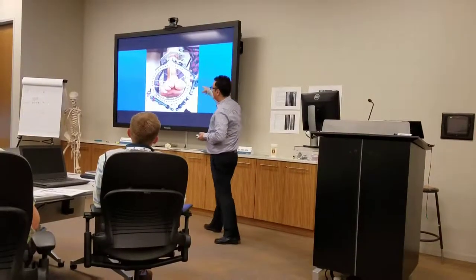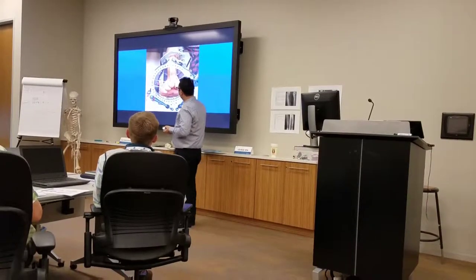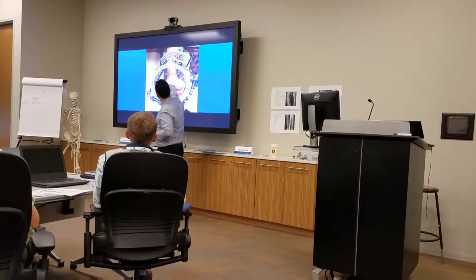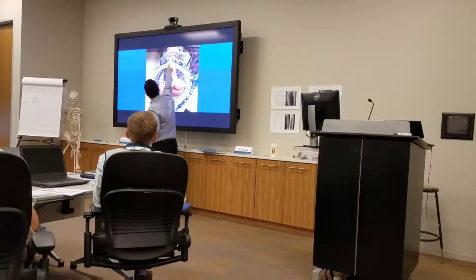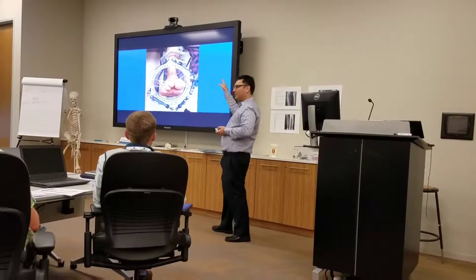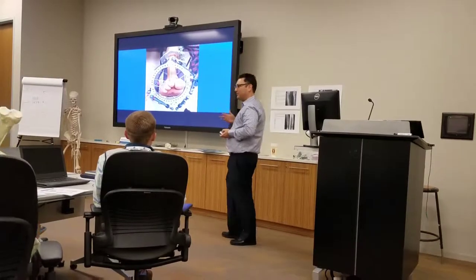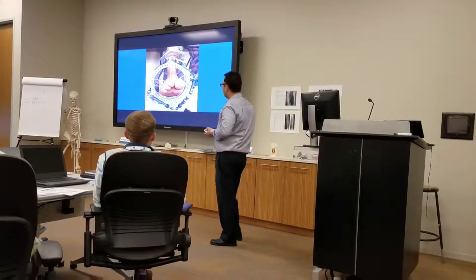So this is actually my patient. I don't do that wire up the top, but you can see that this is where the center of the tab is. That's our second one, and then the second metatarsal I measured was a little bit external. So it's the opposite, instead of that internal rotation. Instead of being 178 external, you're going to go like 182 internal. But it doesn't let you do 182 internal, so it's like 2 degrees internal.